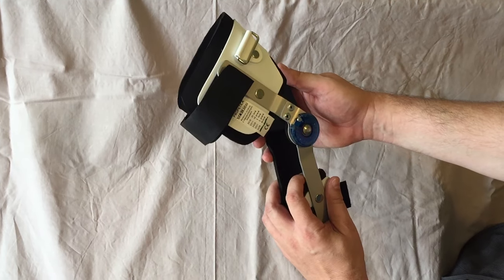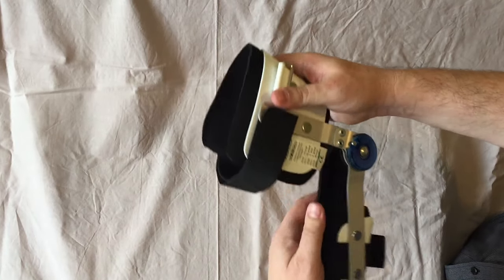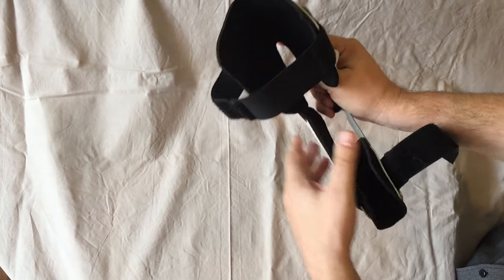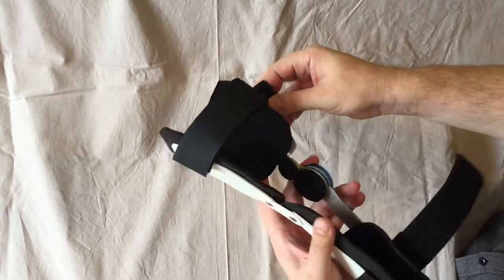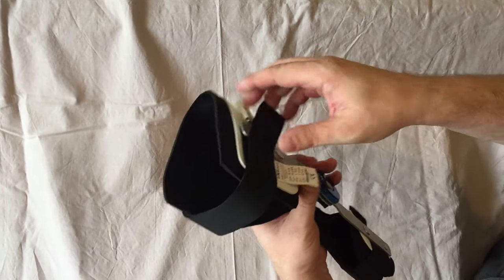This is the orthosis made from plastic, and inside it's covered by neoprene and fixed with two belts, which can be cut according to the needs.